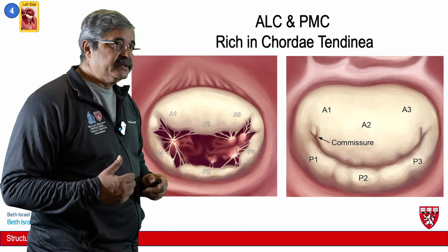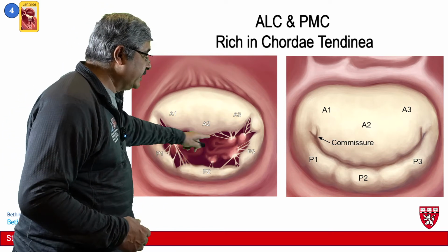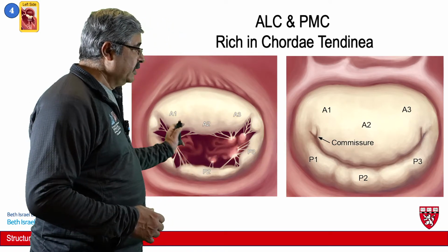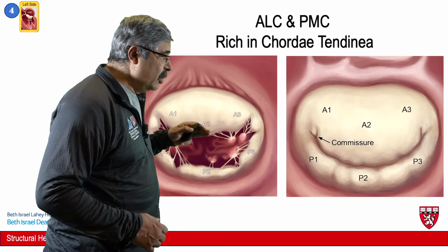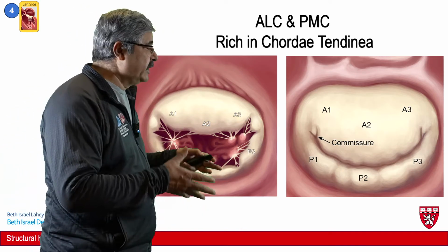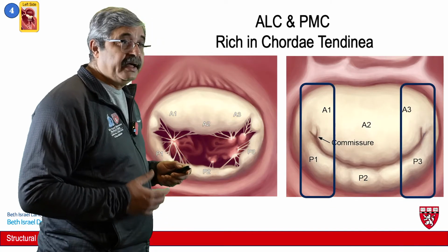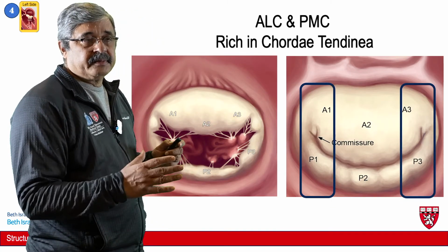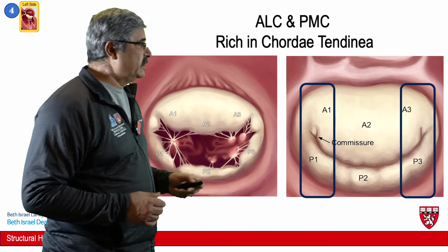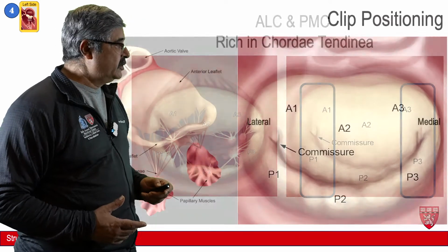Another important reason is that both the posteromedial as well as the anterolateral commissures of the mitral valve are very rich in chordae tendineae. And you want to adjust the position of the clip from medial to lateral above the valve. You don't want to go below the valve and move medial to lateral because you'll be moving orthogonal to these chordae tendineae, and there's a high likelihood of getting caught in there. So these are very rich in chordae tendineae, and that's the place you want to avoid in a simple mitral clipping, because, well, we often have mitral clips deployed in these, but they are very high risk procedures, requiring an utmost amount of experience and imaging.